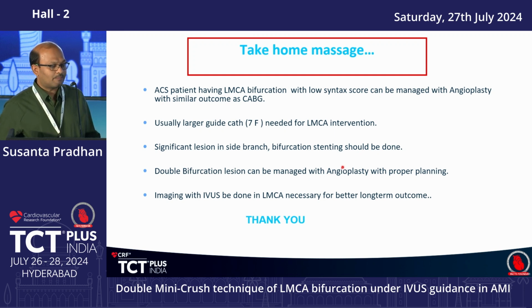And if left main is to be treated with a larger guide catheter, the 7 French should be preferred. And if a significant side branch is there, bifurcation stenting should be done. If a complication like side branch occlusion or dissection occurs, one should switch from provisional to the double stent technique. Double bifurcation can be managed with angioplasty with proper planning, and IVUS is essential, usually in left main bifurcation, for long-term outcome. Thank you.